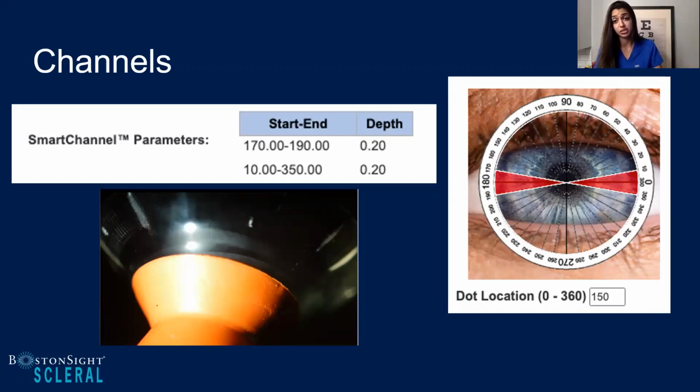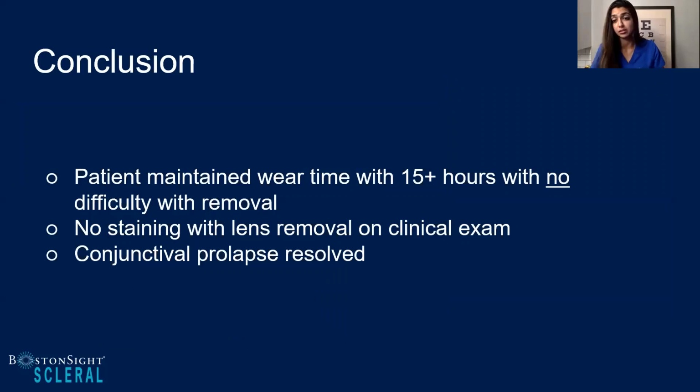What the images really taught me was to evaluate my complication with her fit, but also to monitor her long term, especially with that neovascularization. I think it's important to really evaluate long term how this patient's going to be doing. So great resources between using Fit Connect as well as using my imaging.